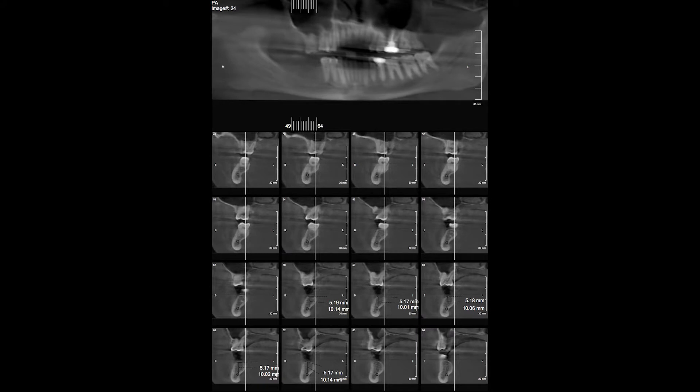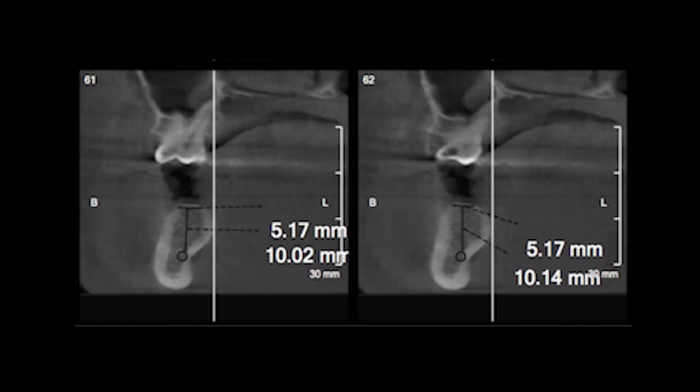I have the CBCT scans for my case right here. We are looking to place an implant in the 4-6 region. Based on the measurements and the CBCT, I have decided to place a 4.1 by 8 millimeter implant, as I have to maintain a safety distance of at least 2 millimeters above the inferior alveolar nerve.